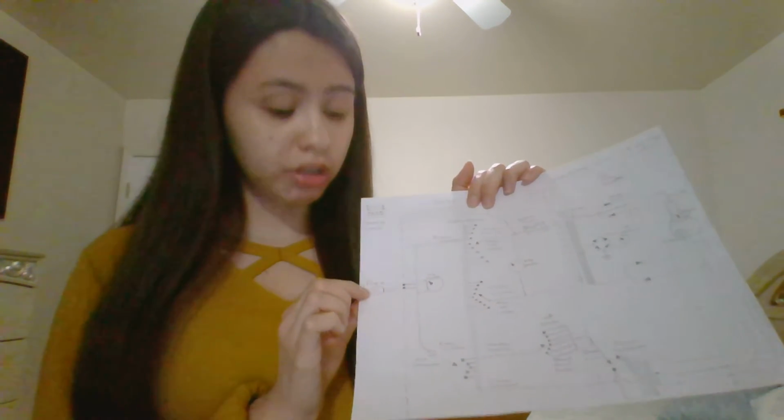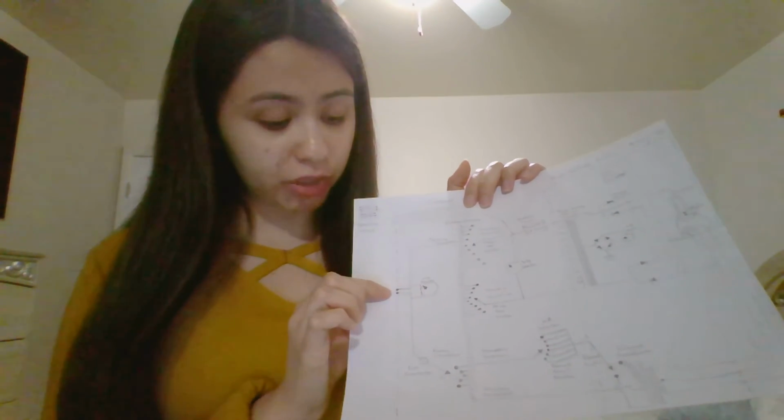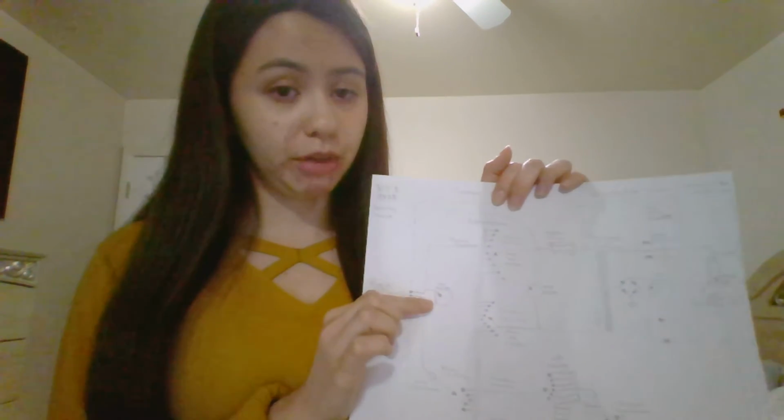And the plug-in is just what provides the energy from the wall. So here in the United States, we have about 60 hertz of energy every time we connect something to the wall. So once we plug that in, the electricity is going to go on through. And right off the bat, there's a line monitor, and all the line monitor really does is read the voltage that's coming in from the wall.